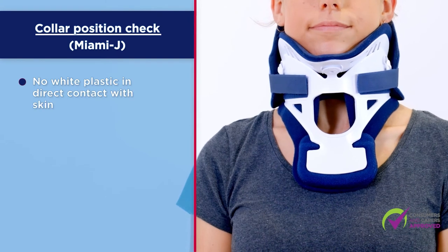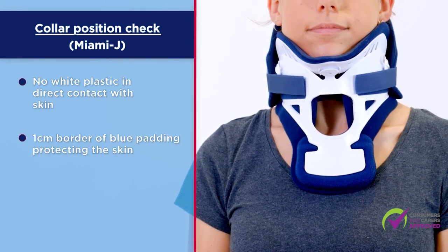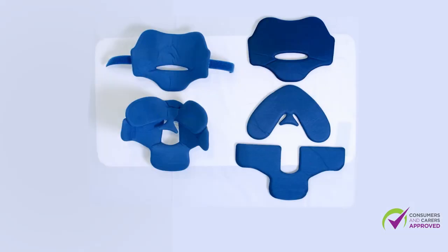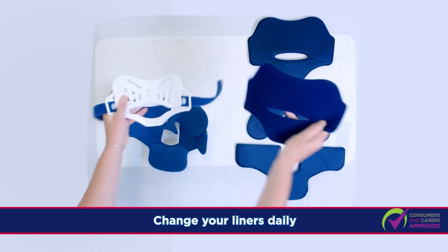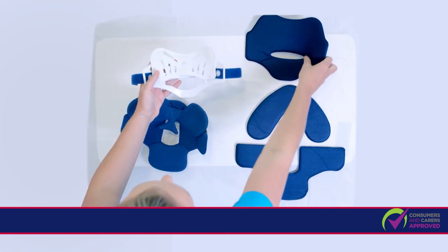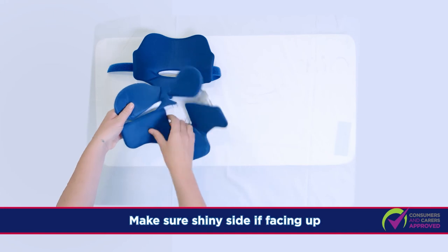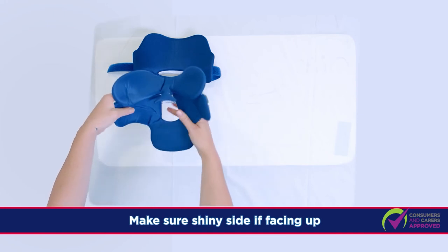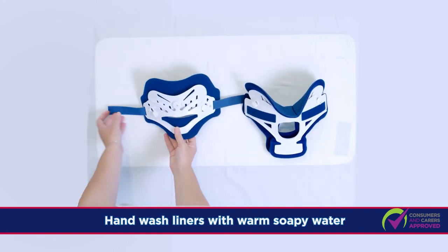There should be no white plastic in direct contact with skin. There should be a 1cm border of blue padding protecting the skin. Your orthotists have provided you with a spare set of 3 blue liners for your collar. Change the liners daily. To change liners, replace each piece with the spare one, one at a time. Make sure the shiny side is facing up. Hand wash the liners with warm soapy water and lay flat to dry.